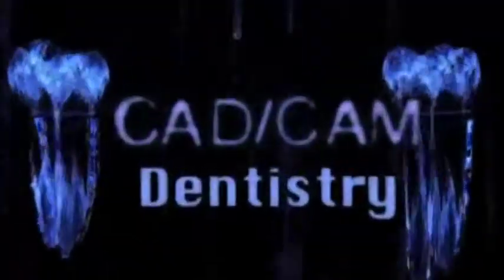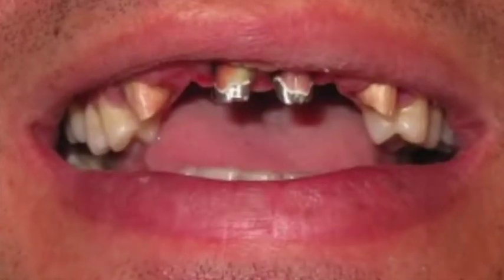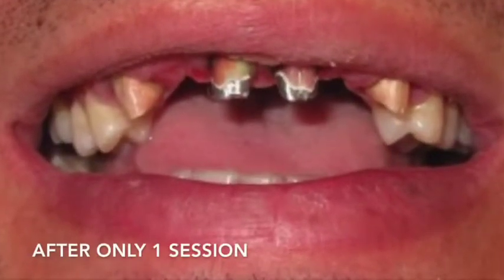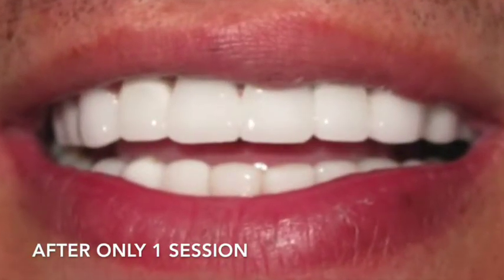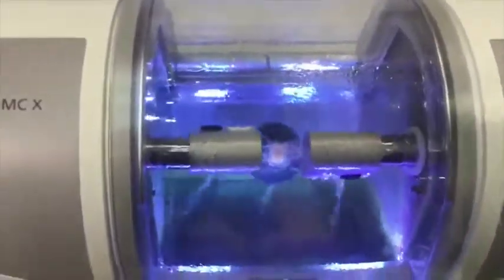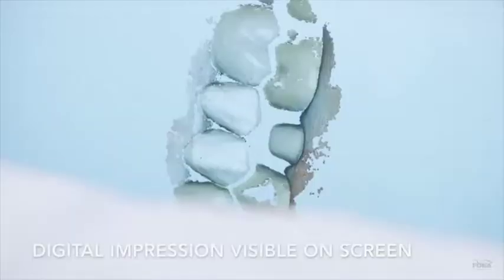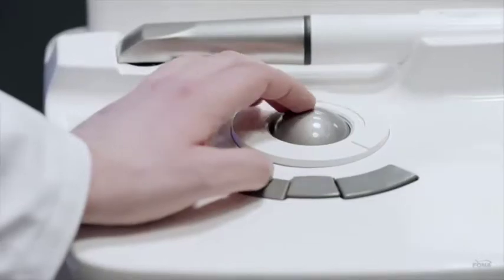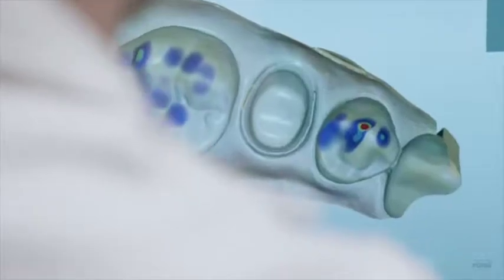Dental crowning in one day is now possible with CAD CAM C-REC. The CAD CAM computer screen displays a 3D custom image of your teeth and gums, allowing your dentist to draw a precise design of the tooth restoration.